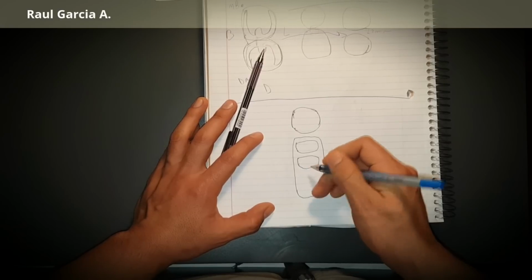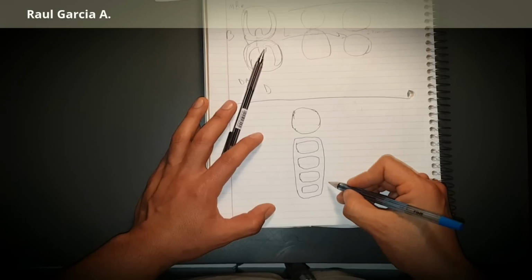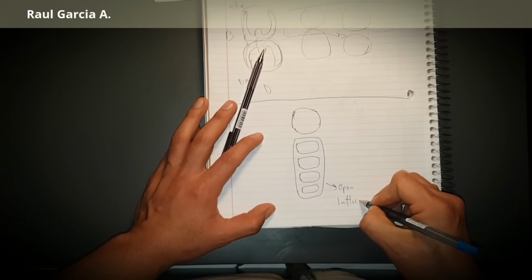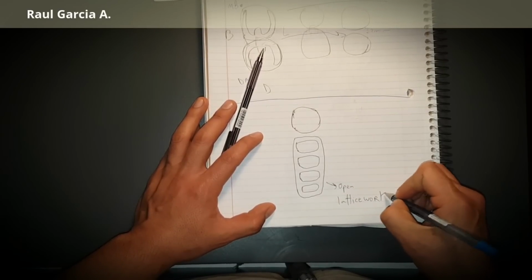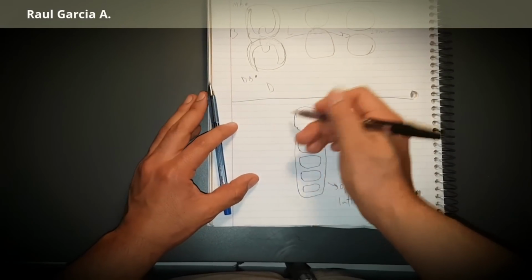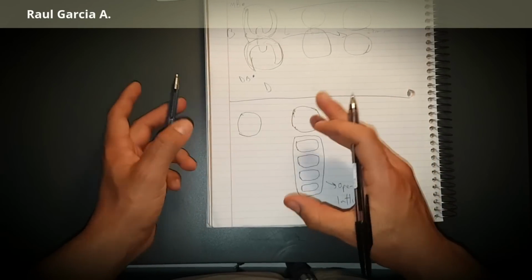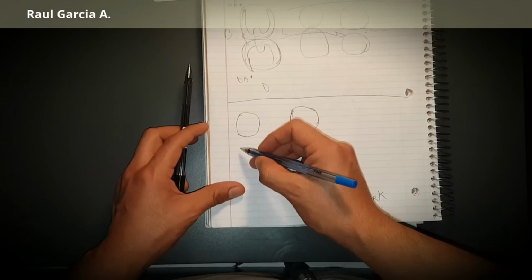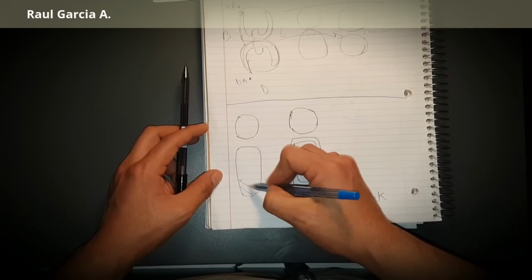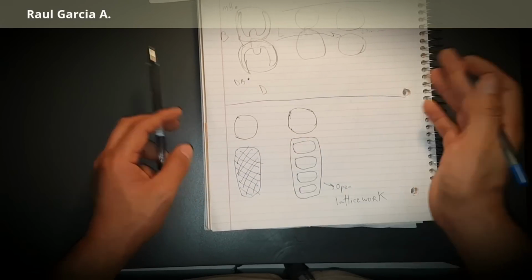You can draw big and nice like that. This is called an open lattice work. Okay. This is open lattice work. It's the design that you put to draw your saddle. You can either put it like that, or you can just draw a mesh also. But we have different indications whenever we use a mesh or whenever we use an open lattice work. So the mesh, we just draw a mesh with things like that.